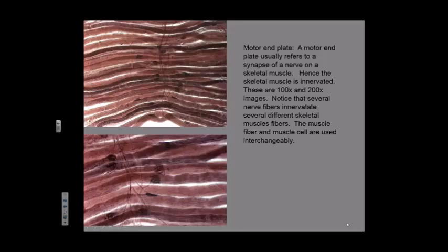So these are dissected skeletal muscle fibers. And you can tell they're skeletal muscle because even at this magnification, you can start to see the striations. These lines right here are actually axons coming in to innervate. And there they are, these are the boutons right here.